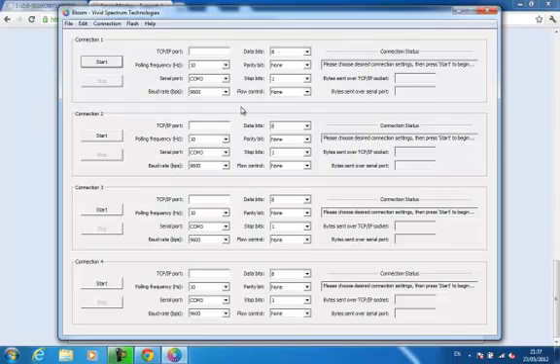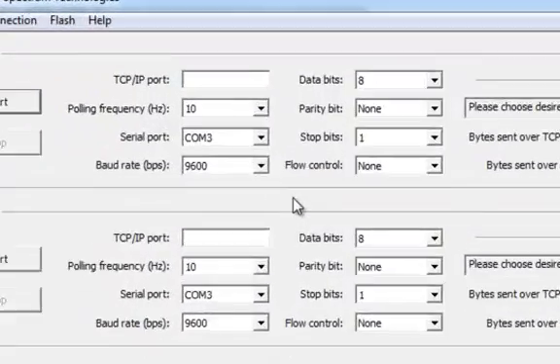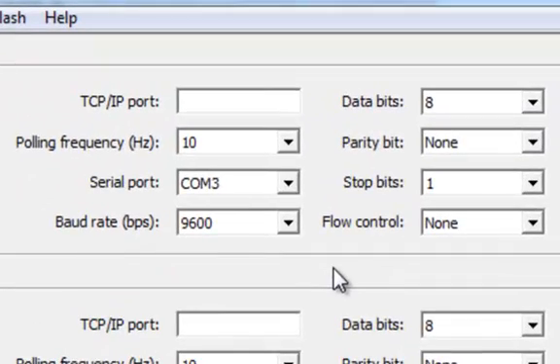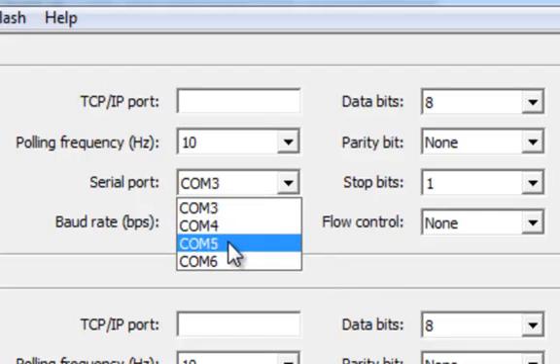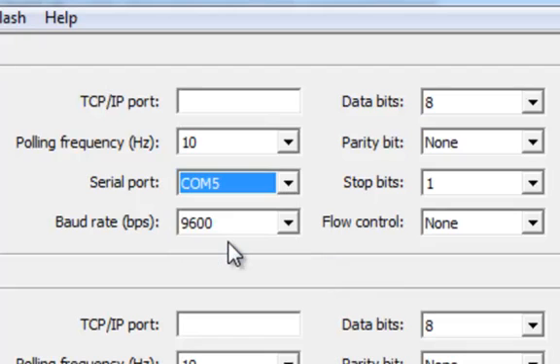First, I select the serial port assigned to the Shimmer. In this case, COM5. Next, I'm going to map this to TCP IP port 20,000.